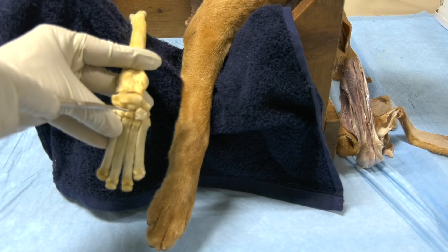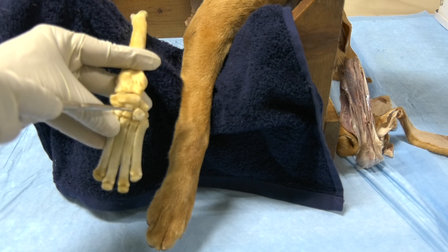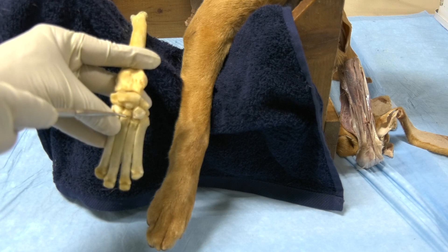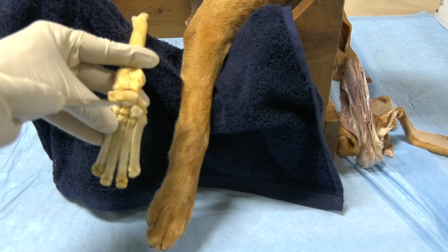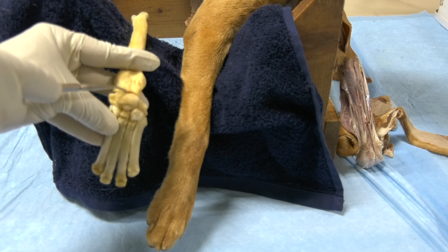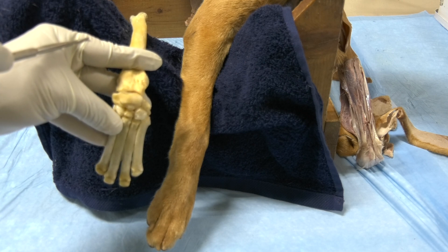The midcarpal joint cavity and the carpometacarpal communicate with each other, so you can inject only one of them for both. The antebrachiocarpal joint has its own joint cavity by itself, so you need to inject it separately.